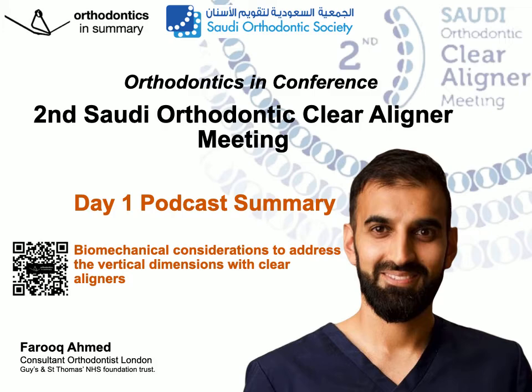So buccal root torque can be a real hindrance. However, a way to achieve it is to have a buccal attachment on these teeth. And what's essentially happening is the aligner is pushing from a buccal lingual direction on this molar we're trying to get buccal root torque into. The attachment itself acts almost as a pivot point, so therefore we are having an extrusive force happening at the buccal aspect of the tooth, allowing the palatal aspect to intrude, and therefore we're getting buccal root torque occurring. He also described the use of intrusion in the aligner to also help this palatal cusp to come up.